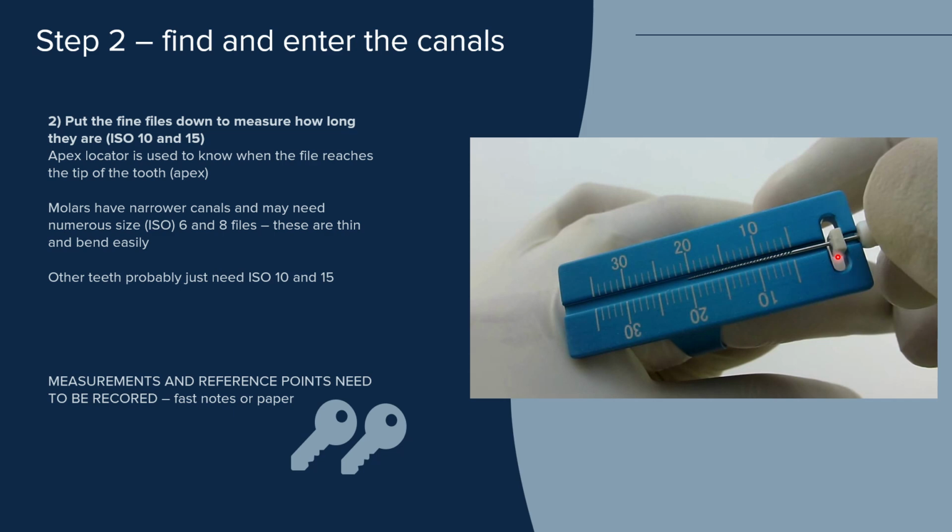They're not really holding the rubber stopper to the edge. But anyways, as we discussed earlier, molars have narrow canals, so we might need a 6 or an 8 file. Have them ready. These are thin and they bend easily, so just have a fair few of them out. Obviously, don't open the packet, just make sure they're on standby.